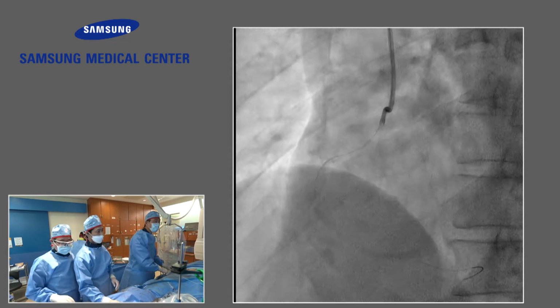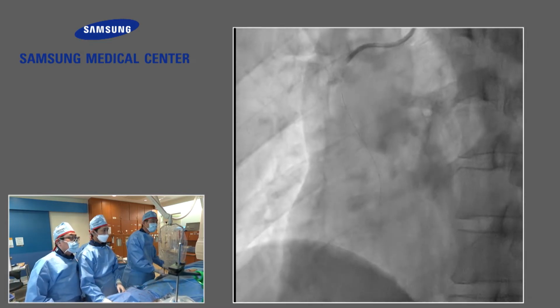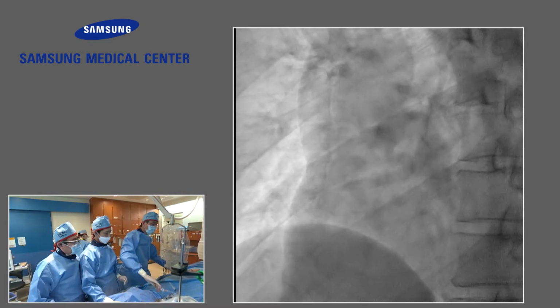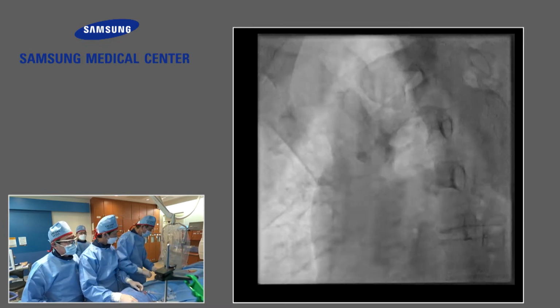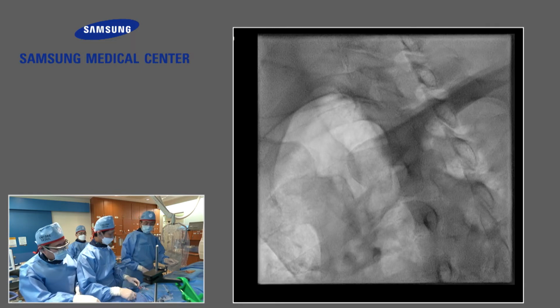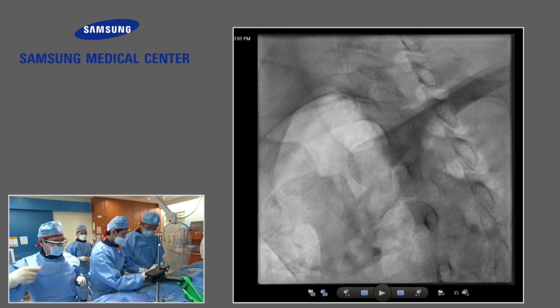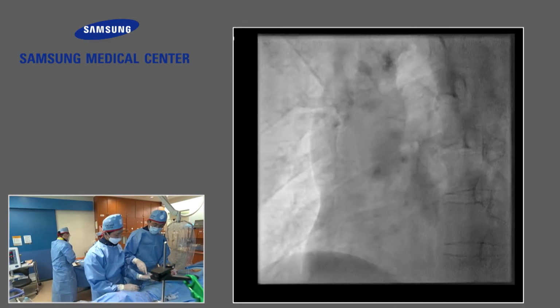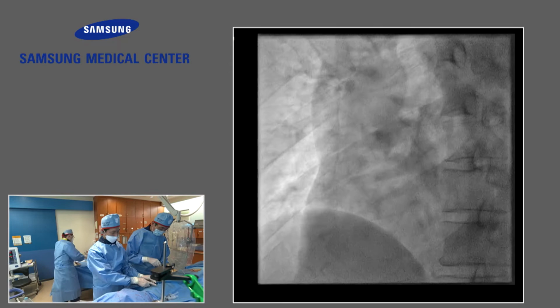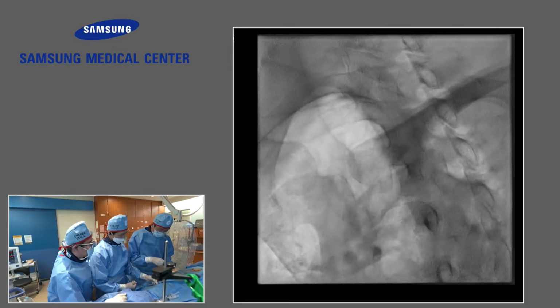Is there some risk with the balloon outside the guiding catheter? Aspiration of the cut balloon tip is better. No, I don't like to take more risk. Rewiring may be very easy. Why did you use an uncertified balloon?